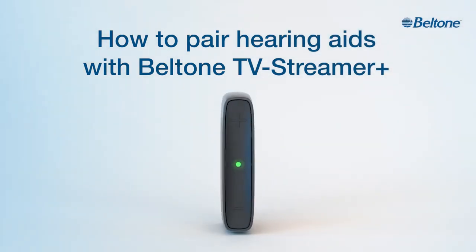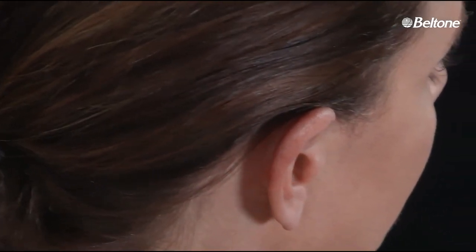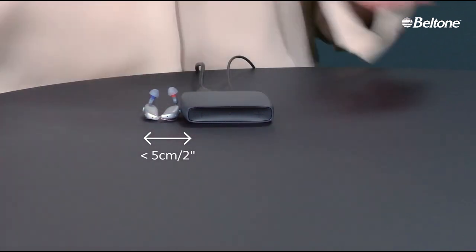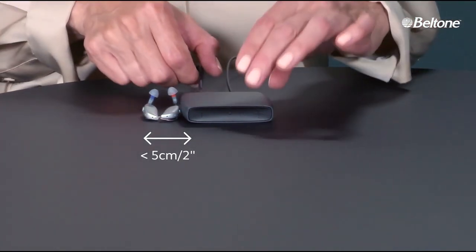Title: How to Pair Hearing Aids with Beltone TV Streamer Plus. A right hearing aid is removed from behind the ear of a brunette woman and laid down next to the left hearing aid. They sit next to the Beltone TV Streamer Plus. Graphics appear measuring the hearing aids at a total of two inches side by side, showing the streamer is only slightly longer than double that amount.